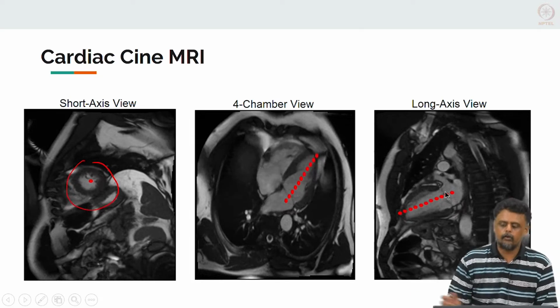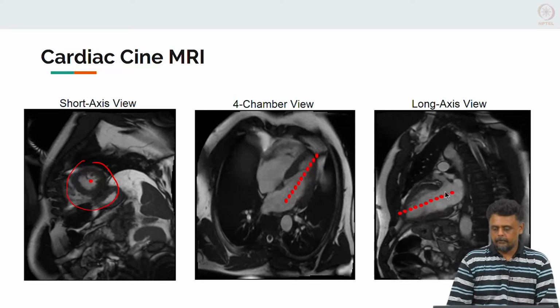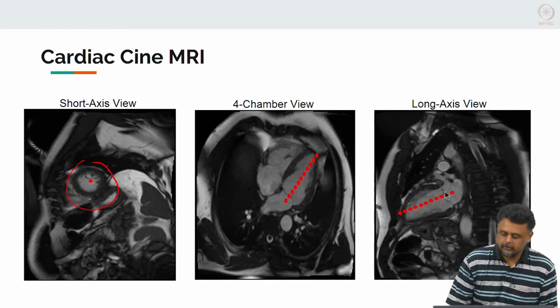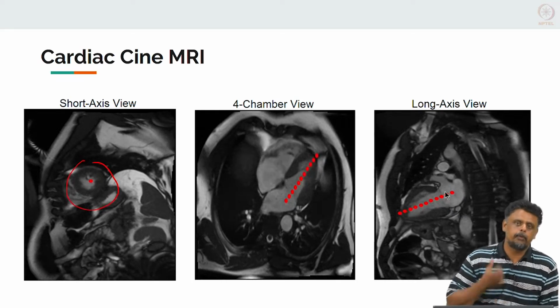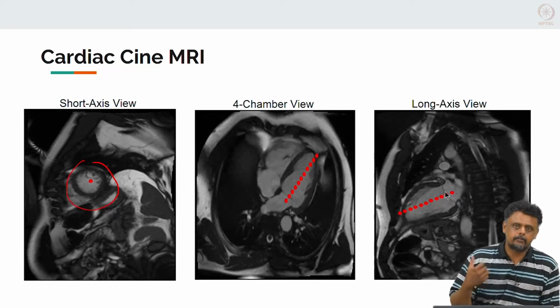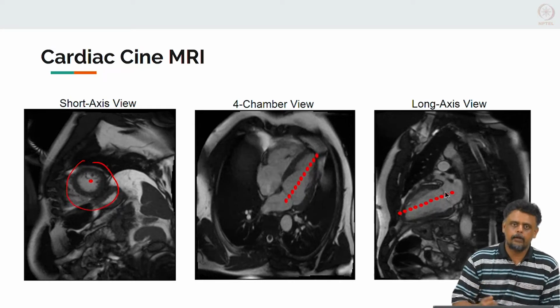Typically, for cardiac MR imaging, there are many diagnoses that are done with cardiac MRI, but what is of most interest to clinicians, many clinically important factors, are obtained by looking at the left ventricle, because that is the one that pumps blood out into your system. Any weakness, defects or pathology there is obtained by studying the left ventricle during the cardiac cycle, how it pumps blood out.